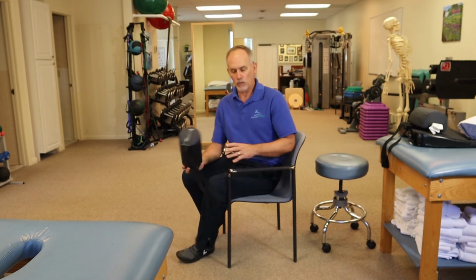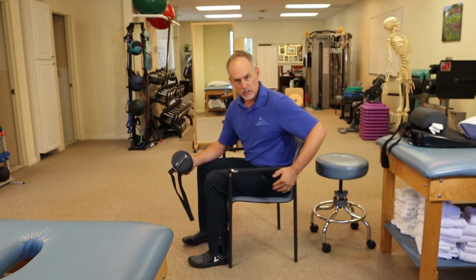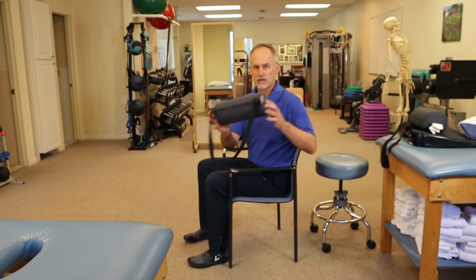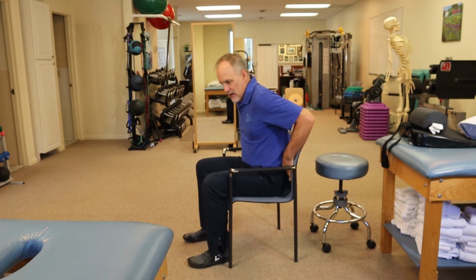Okay, so how do you use the roll? Besides being a skeleton, we've got to show you how to use the roll in a real person. So what I like to do is scoot back as far as you can. So you see this vertical part right here. You want to get back as far as you can, roll like so, and you want to sneak it in and then lean back into the roll.